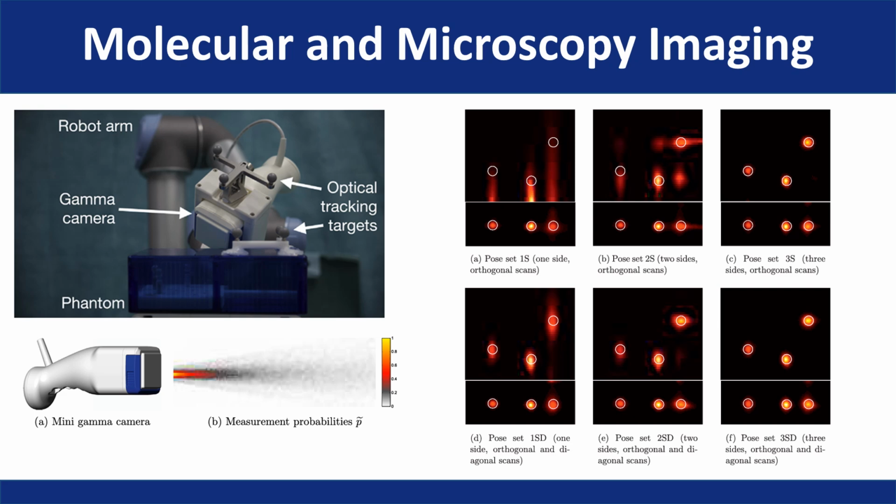These results highlight how this innovative setup combines real-time imaging and precise 3D reconstruction. Addressing the challenges of traditional bulky systems, it allows surgeons to visualize and target specific radioactive regions efficiently, improving outcomes in procedures like sentinel lymph node biopsies.